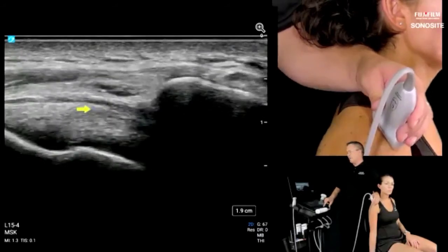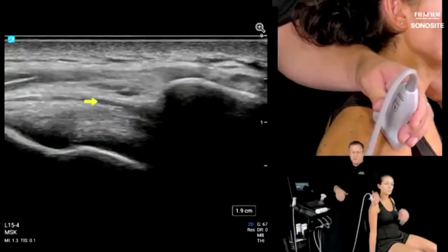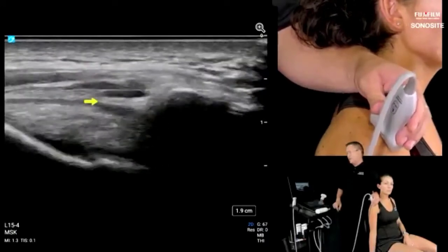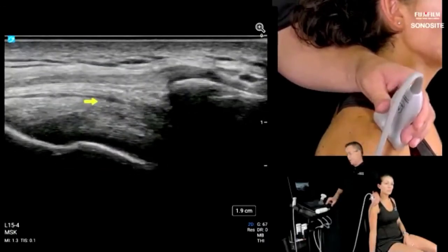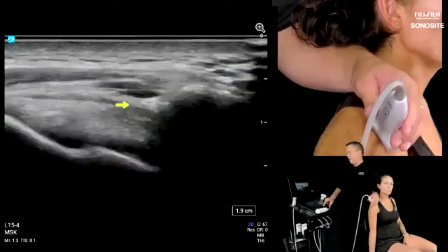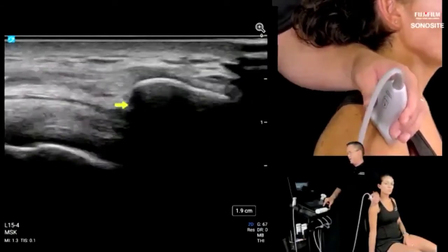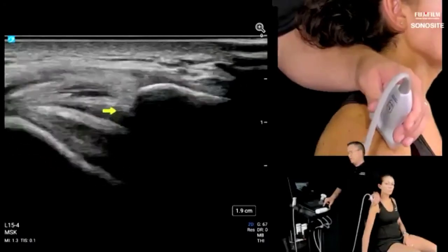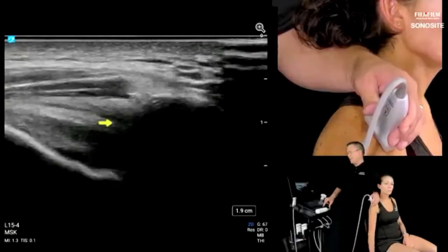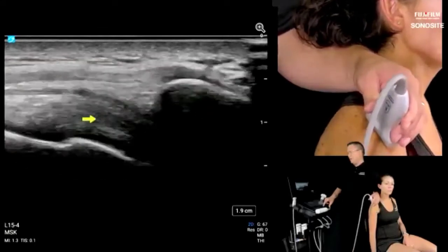So there's a lot of layers here, and using ultrasound to discern, hey, is it a real bursitis, or are there adhesions in there? We can evaluate this entire interface really nicely. So I'm going to have our model here today just chicken wing up a little bit, or abduct. Let's watch that, and then back down. And you get to see, hey, once that tuberosity clears, you're good.